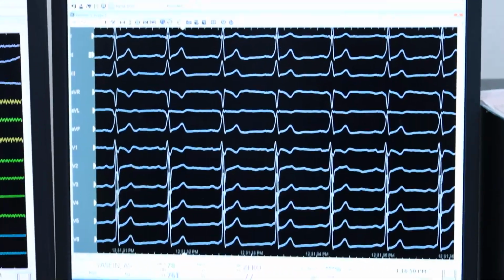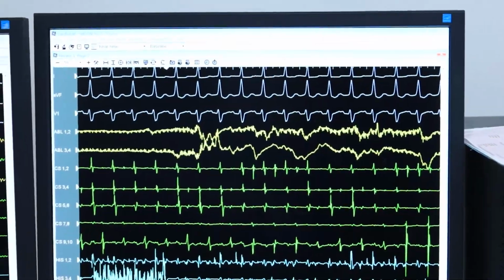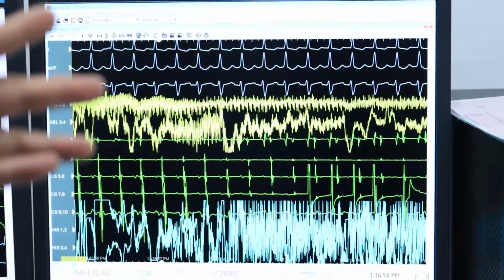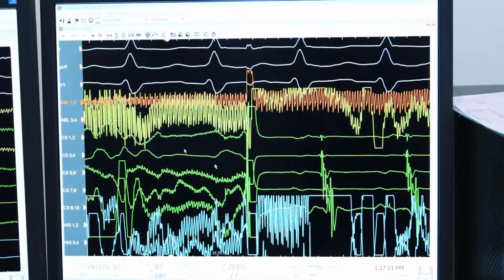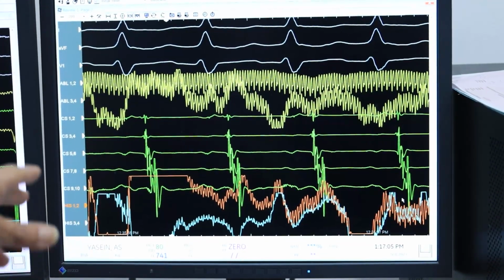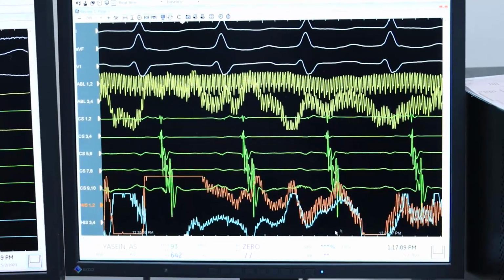Placing the catheters, of course. He went into the tachycardia. Very good, as we saw in his clinical tachycardia. We placed the CS catheter before we placed the His, and you can see this eccentric activation. So this is a left lateral accessory pathway.